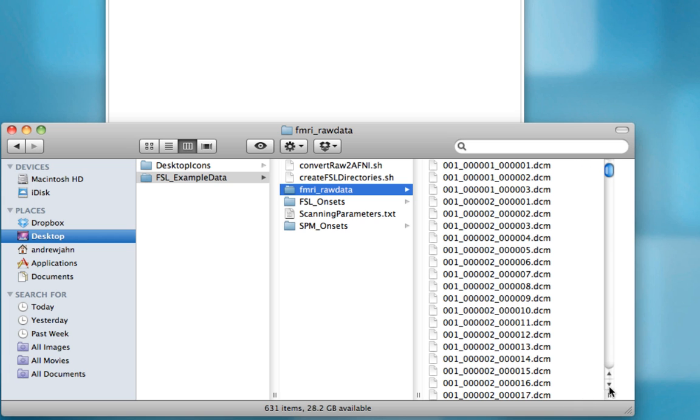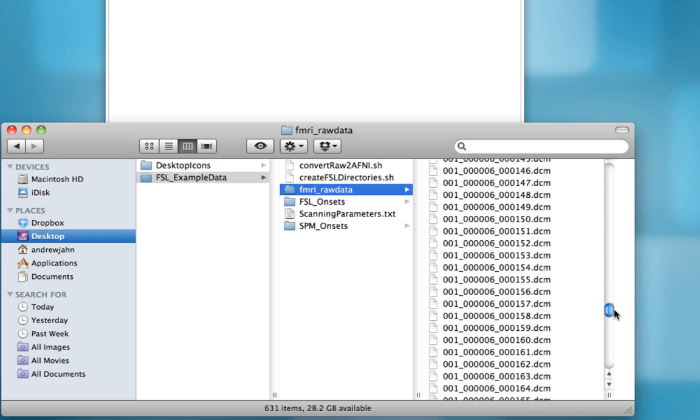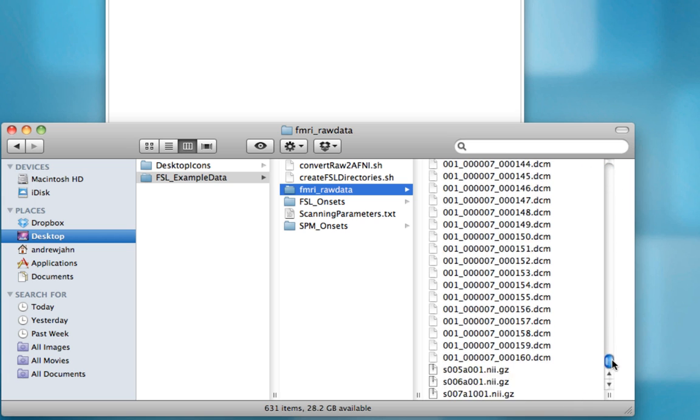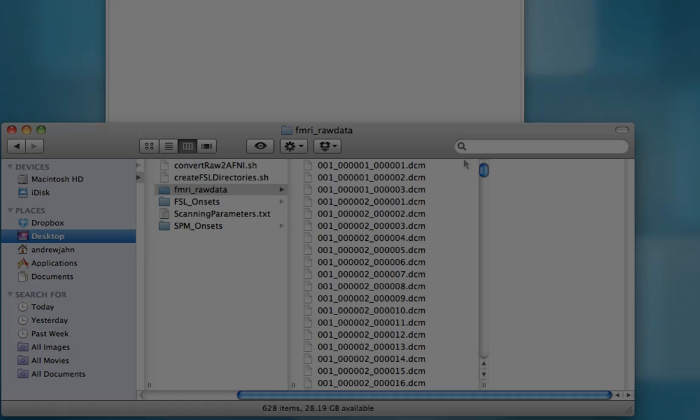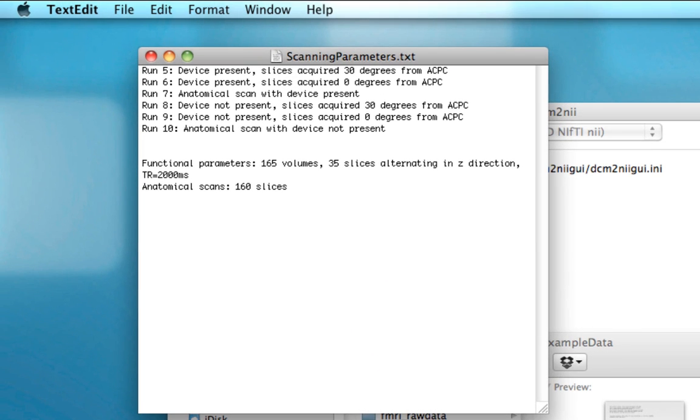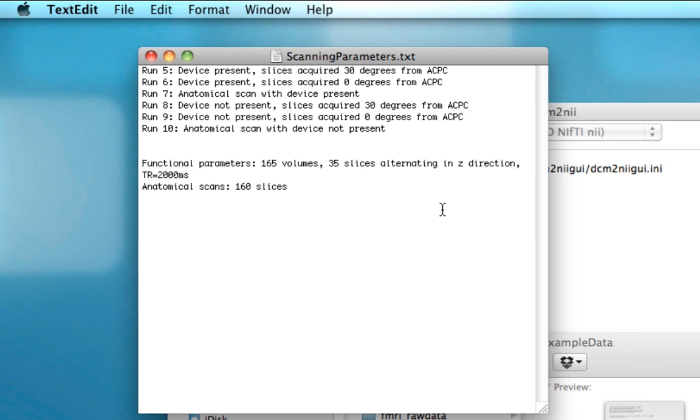You can see that we have hundreds of DICOM images here. Another important thing to note within this folder is this text file called scanning parameters. This gives information about each run.